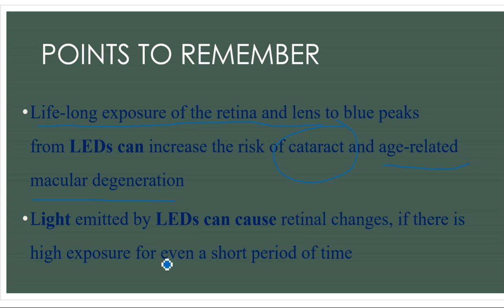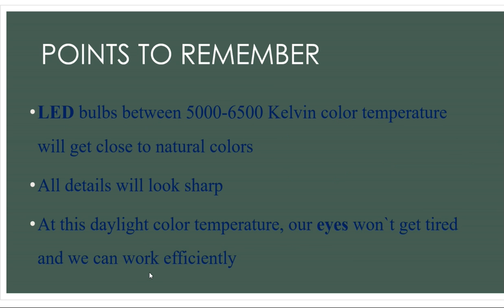Even a high exposure for a short period of time is going to damage your retina. So the take-home message from these two lines: whenever you are in the operating theater, don't look towards the OT light, or these light cables, or the laparoscope or telescope, the light coming from the telescopes.